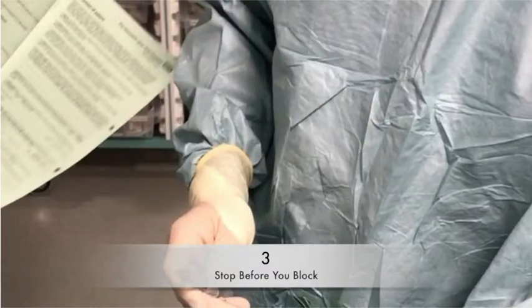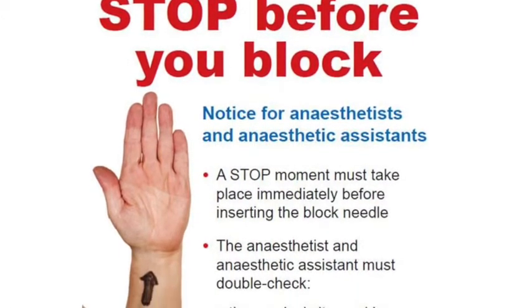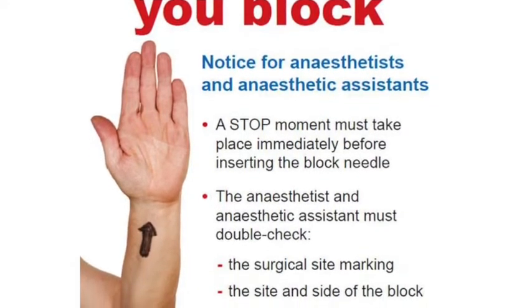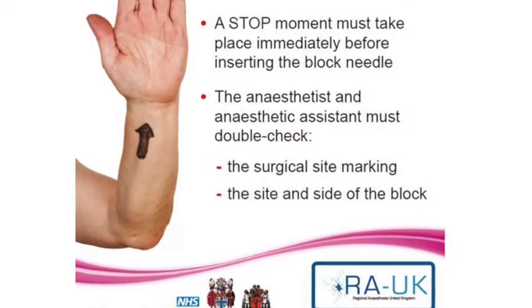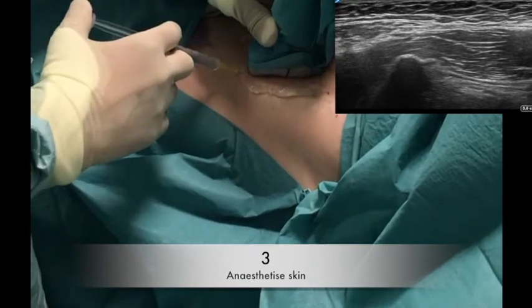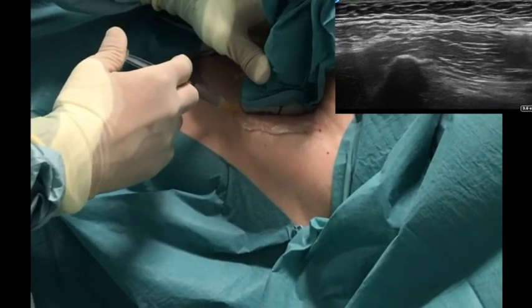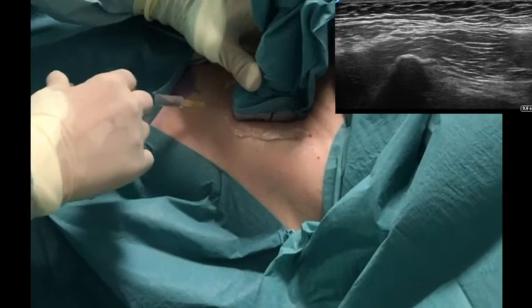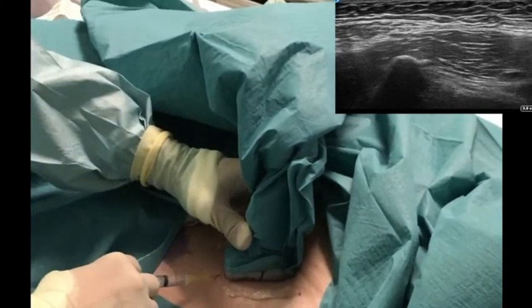Step 3 is the stop before you block, which is an important safety initiative and it is vital that this is performed prior to any needle being inserted into the patient. Notice now that the camera position has changed and the patient's head is now on the right hand side of the screen. It is now time to anaesthetise the skin of the planned entry point using a few millilitres of lignocaine and an orange needle.